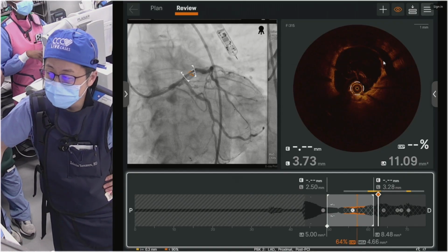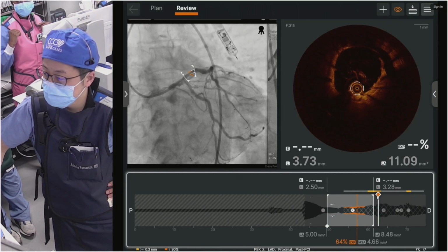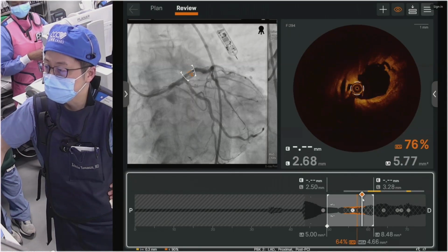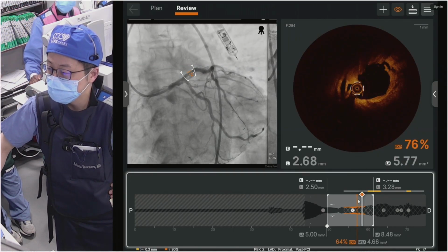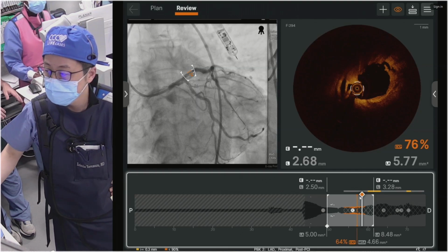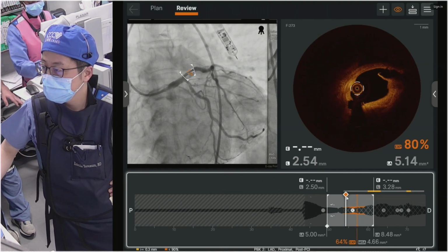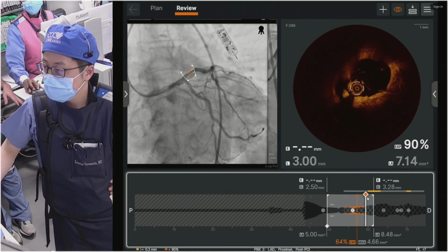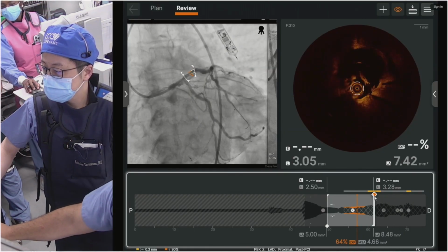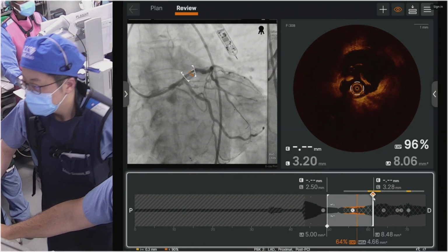Measure another lumen behind the previous stent. But the lesion starts at our tightest lesion. So there is some medial dissection. It propagates through the previous stent, behind the stent. Okay, interesting. 16, right? Okay, so I think the OCT was right. Length is 16. What is your imaging length?